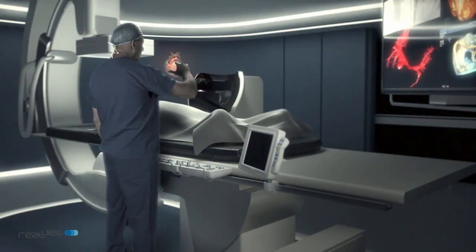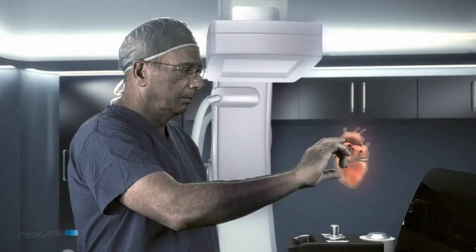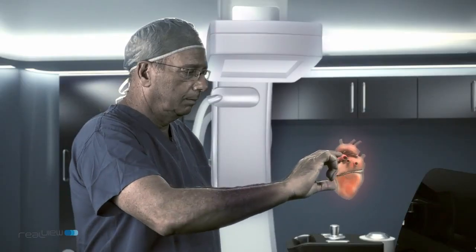We are targeting our products to be used in the future for surgical pre-planning, medical robotics, and 3D fetal imaging, as well as for additional medical and non-medical applications.